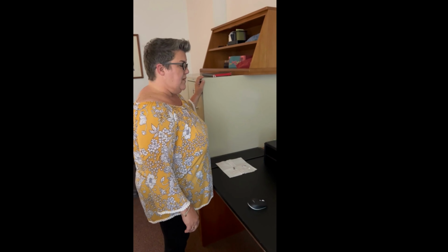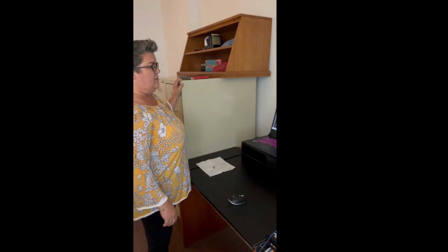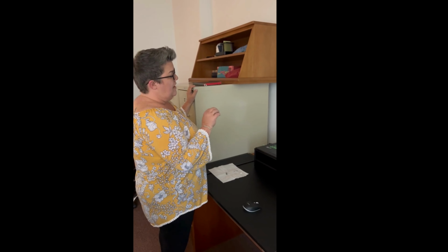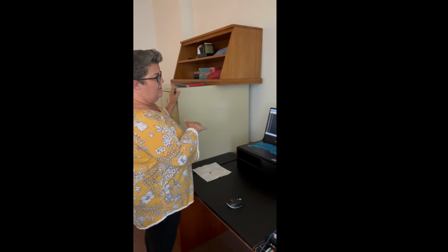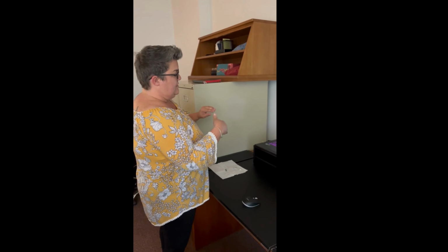Video portion will be looking at connections. So we're going to start this session up. I already have a session here that is a 19 channel, and we'll get into how to get here in a different video. But what we're going to do now is start this session, and what we're going to be looking for is to see how good of a signal we have coming from each area or each electrode. So we're going to go ahead and hit go.